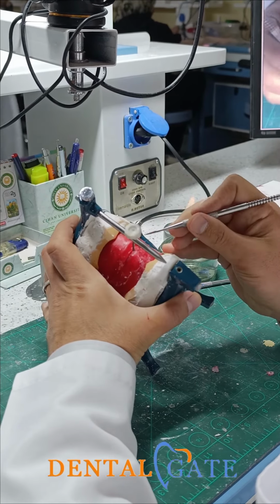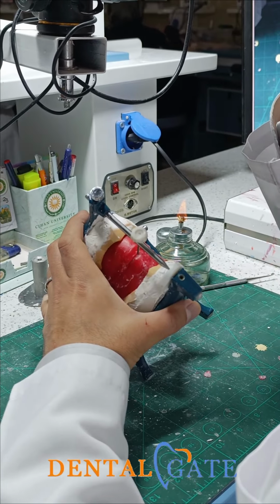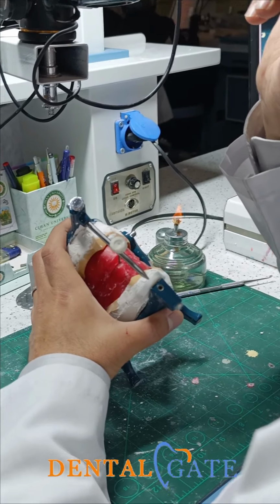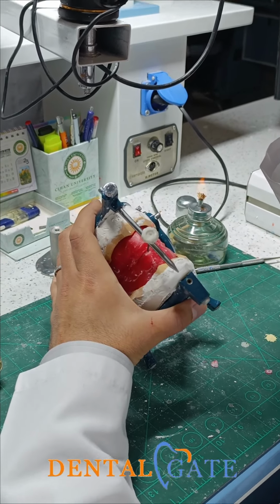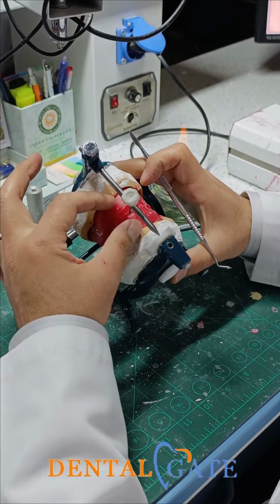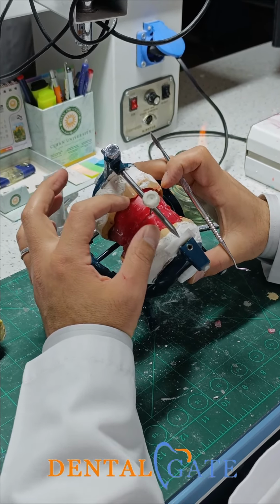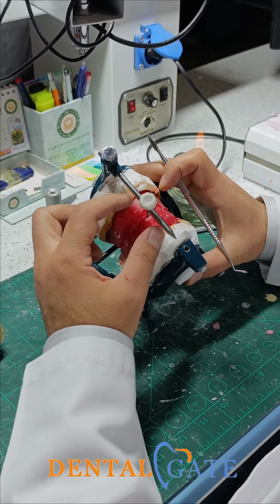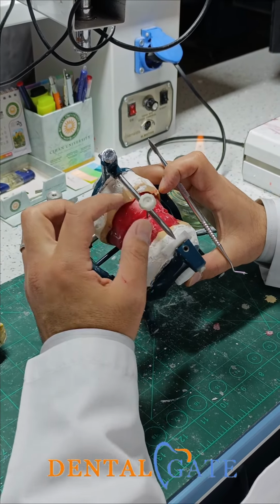We can make a V shape, or we can make that within the light body registration, light body silicone registration, to ensure the relationship in the patient's mouth is precisely transferred to the articulator without any error.